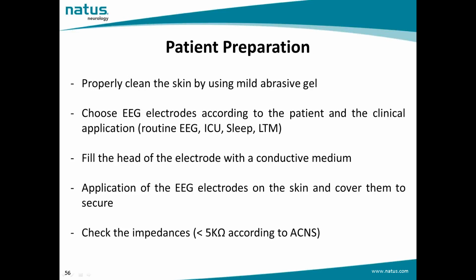First of all, we have to start to clean properly the skin surface by using a cotton swab, preferably with a flexible stick, in order to apply the skin preparing products. Typically, we use a mild abrasive gel. Then, we will have to choose proper electrodes according to the patient and the clinical application.